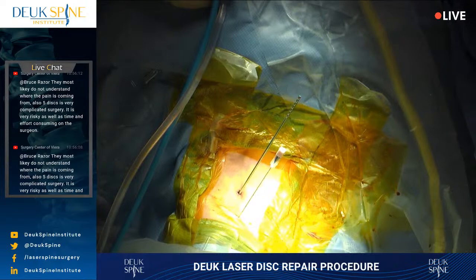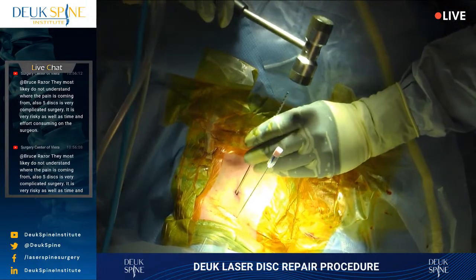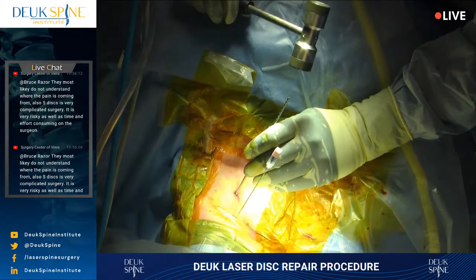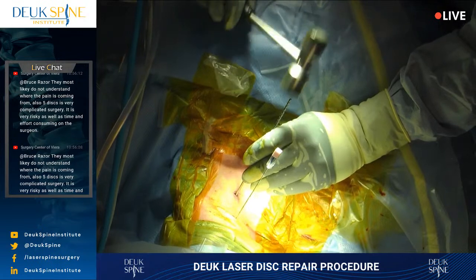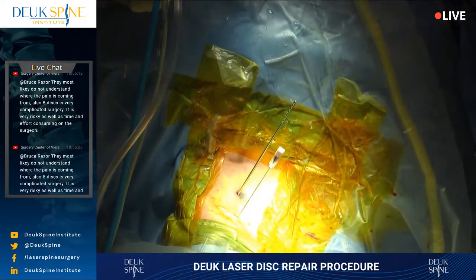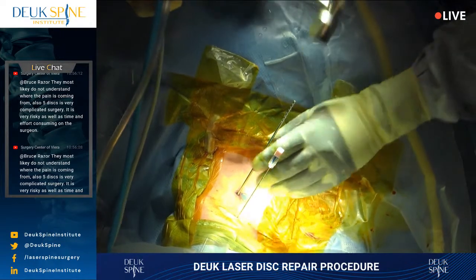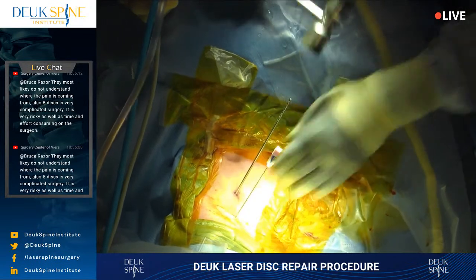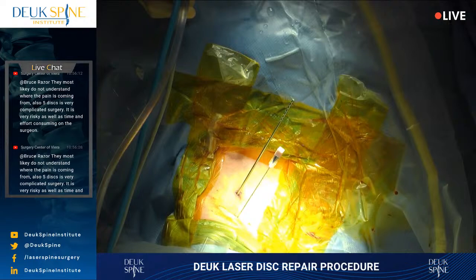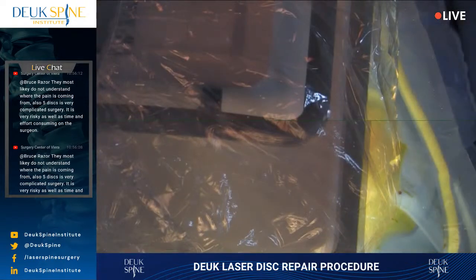Let me have the mallet. Shot. Shot. That is seriously collapsed. Give me an AP. Thank you.